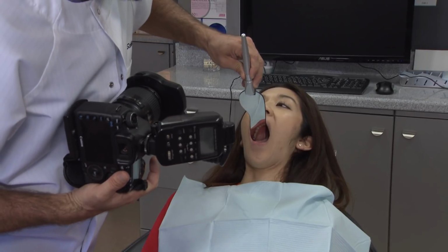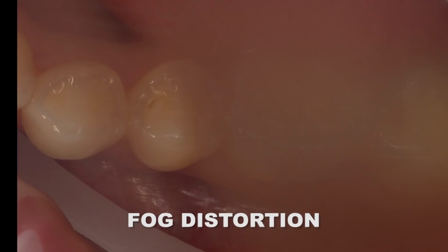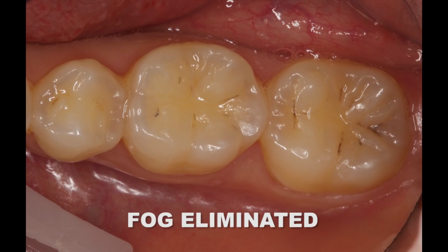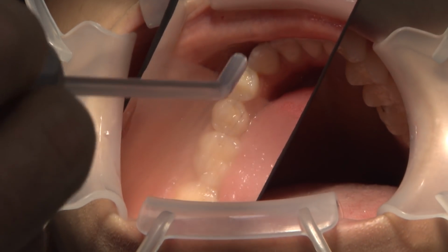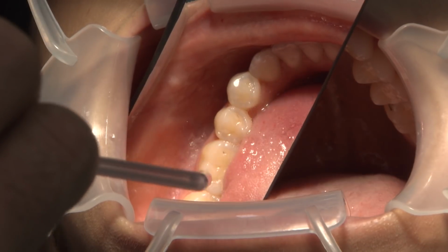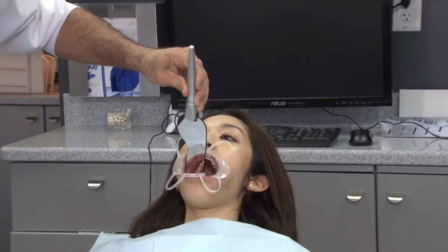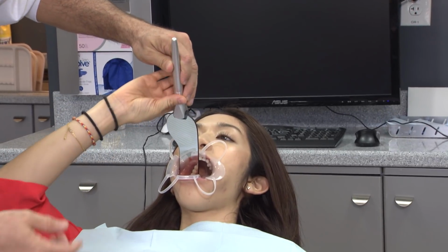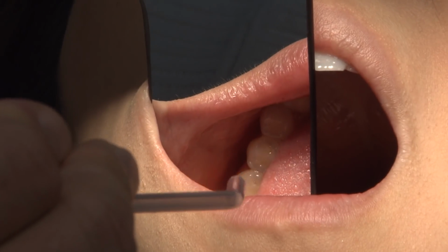Intraoral mirrors are most susceptible to fogging from breath condensation. A mirror can be heated in water to minimize fog accumulation. However, I try to stay far away from this method simply because the water adds one more layer of distortion that I already don't need to work around. Instead, simply applying a steady air blast from an air-water syringe will instantly defog the mirror and allow for a clear, reflected shot. If you are the only practitioner available, the use of an intraoral mirror with a handle is convenient to allow the patient to hold while you simultaneously defog the mirror and acquire the photo.